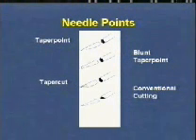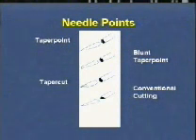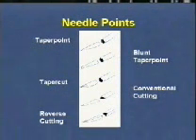The conventional cutting needle has a triangular cross-section with the apex of the triangle on the inside of the needle curvature. The effective cutting edges are restricted to the front section of the needle and merge into a triangulated body, which continues for half its length. The body of the reverse cutting needle is also triangular in cross-section, but has the apical cutting edge on the outside of the needle curvature. This improves the strength of the needle and particularly increases its resistance to bending.